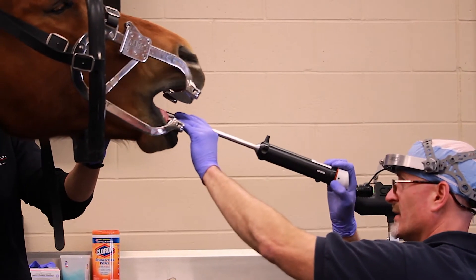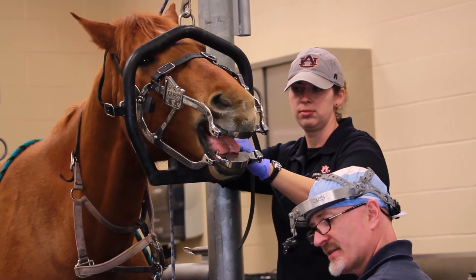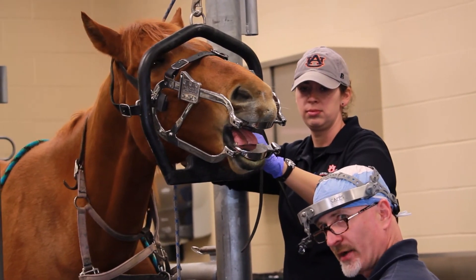In addition to being able to do a more thorough exam of the horse's oral cavity and providing the client a much better service, I think it's a wonderful teaching tool. Since this is a teaching institution, it really allows the students to be able to see what we're seeing in the horse's mouth.